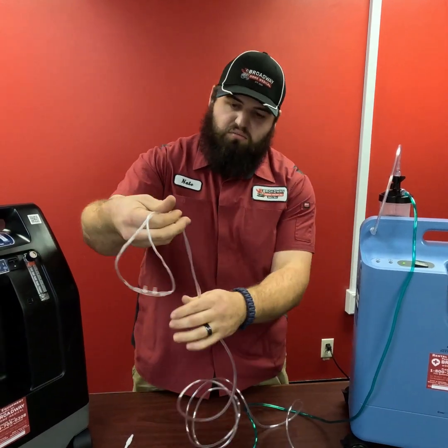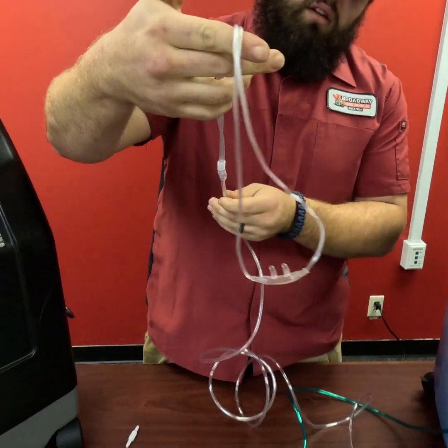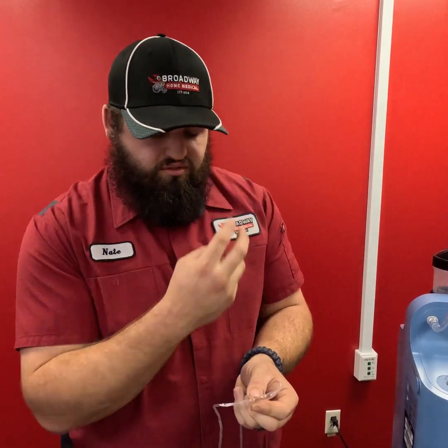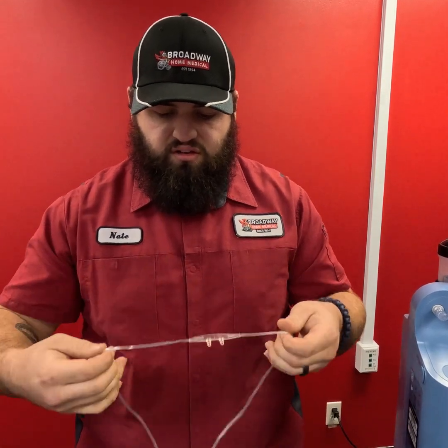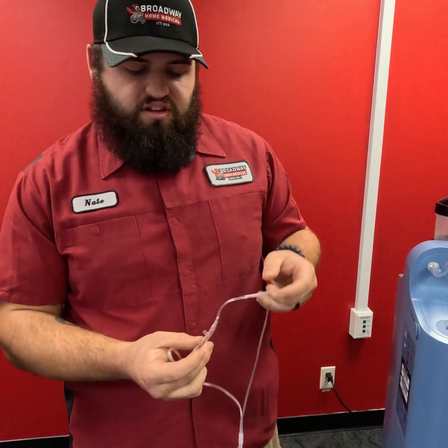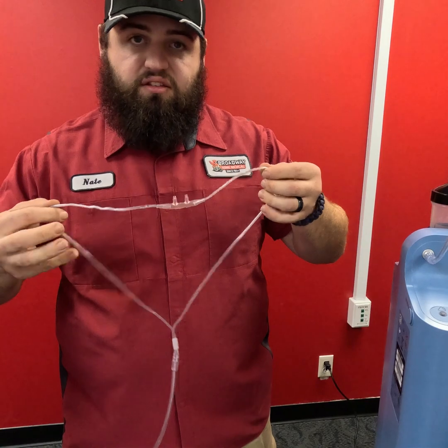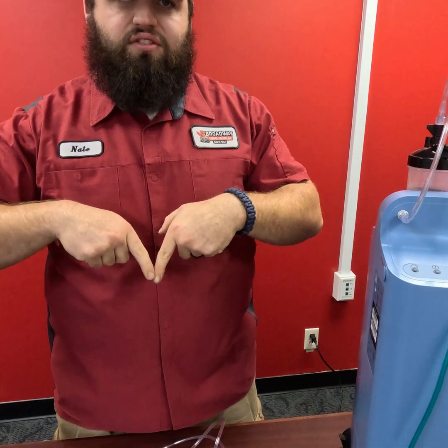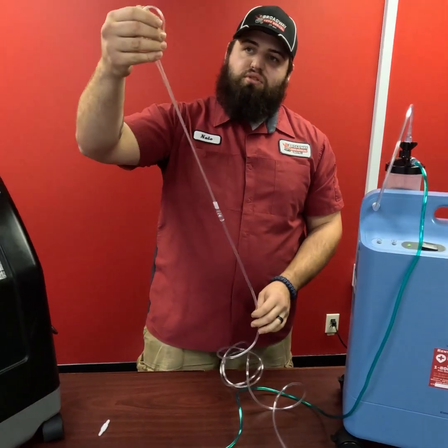All right, and this is going to be your nose cannula. Now your nose cannula is going to run into your nose. You'll see that it kind of curves like that, and most of the time you want it to curve into your nose. So you'll curve into the nose, and you'll actually take and draw up and around your ears and let it hang in the front. So like I said, the first thing that you usually want to do is put that right into your nostrils, and then with both hands draw up around your face, around your ears, and hang in the front. And that's how you go ahead and put your nose cannula on.